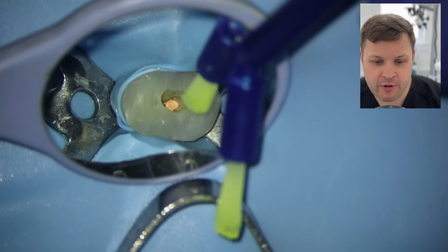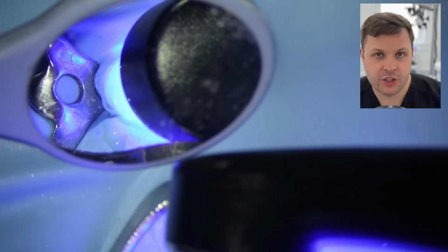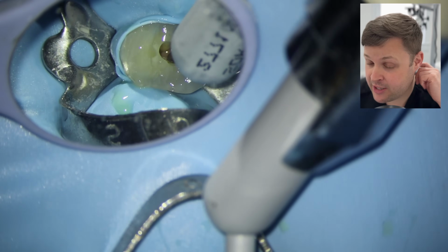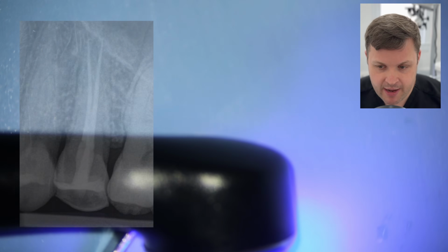Now, this obturation is looking a bit tidier, and I'm going to use a little bit of Scotchbond, drying, curing. Scotchbond is self-etching, by the way, and then I'm going to use some SDR. This is a bulk flow composite, and then we look at the X-ray.